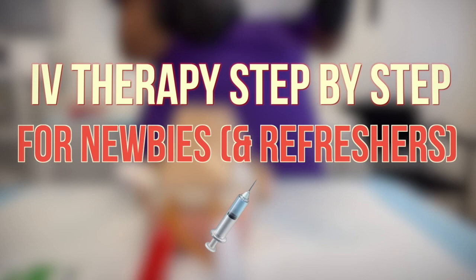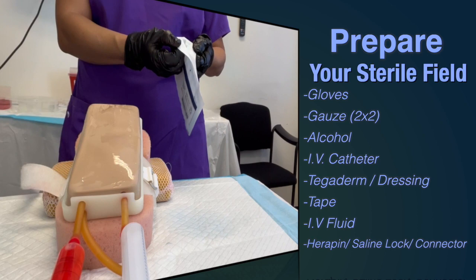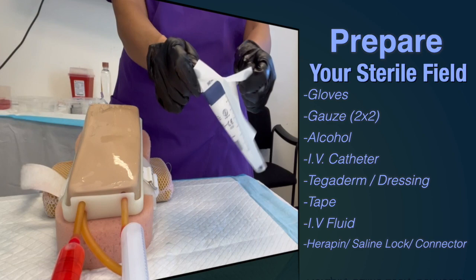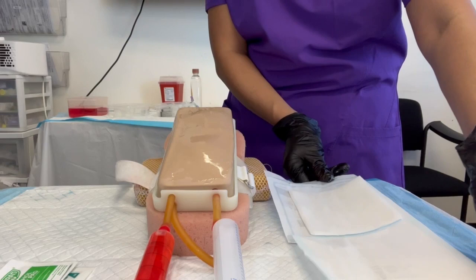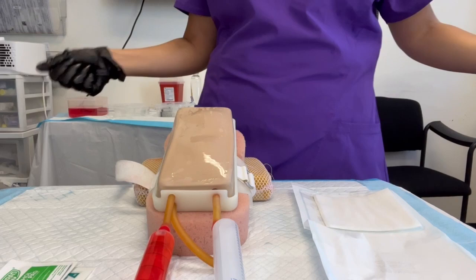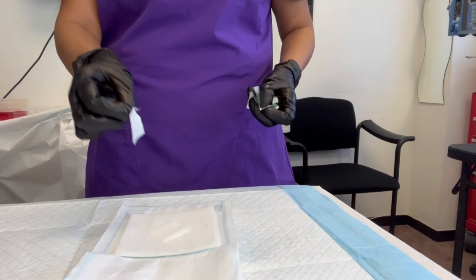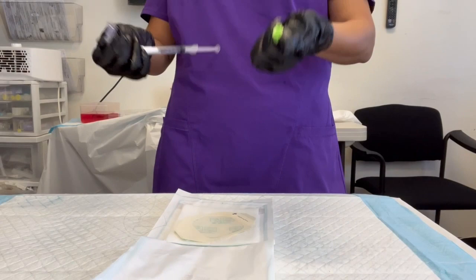How to prep for sticking — we're just gonna let it marinate as much as possible. You want to drop everything in your sterile field. IV is aseptic, so I'm gonna show you how to open the four-by-four to maintain sterility. Watch me — open it all the way through. Do we touch anything on the inside? No. We're just gonna drop it in like this. Do not flip the flaps. Open it all the way up, do not touch anything on the inside, do not put any packaging in or grab it on the side.